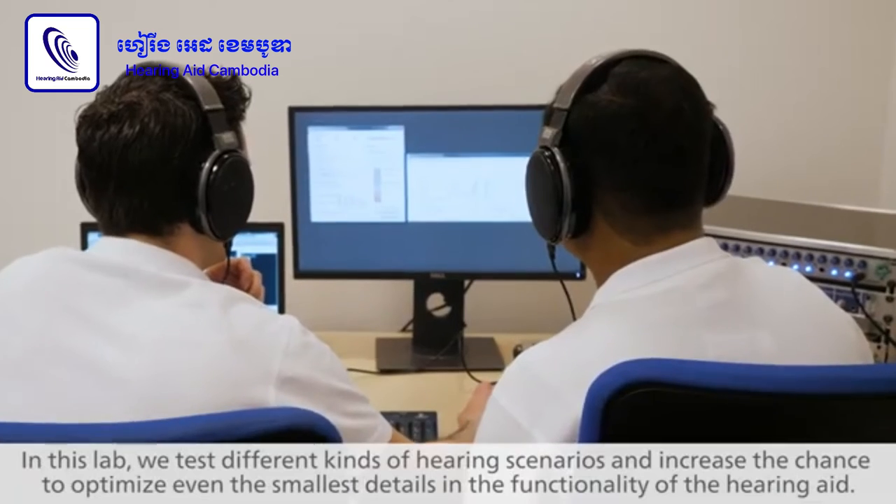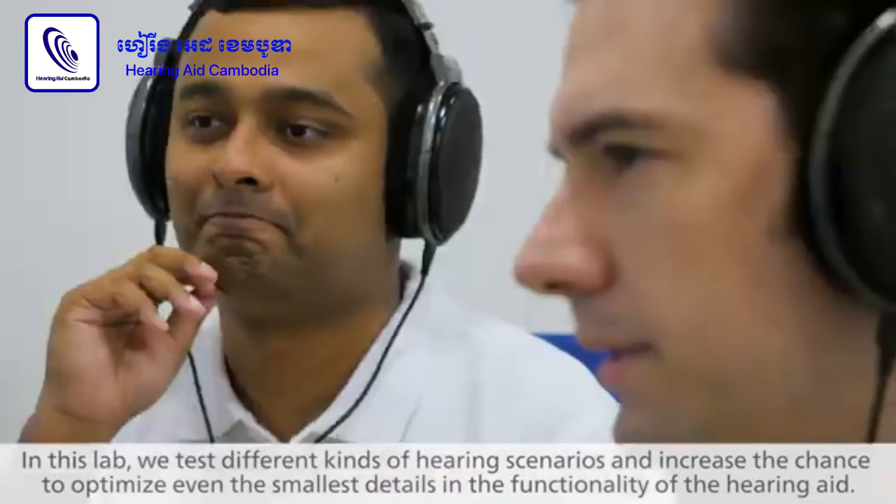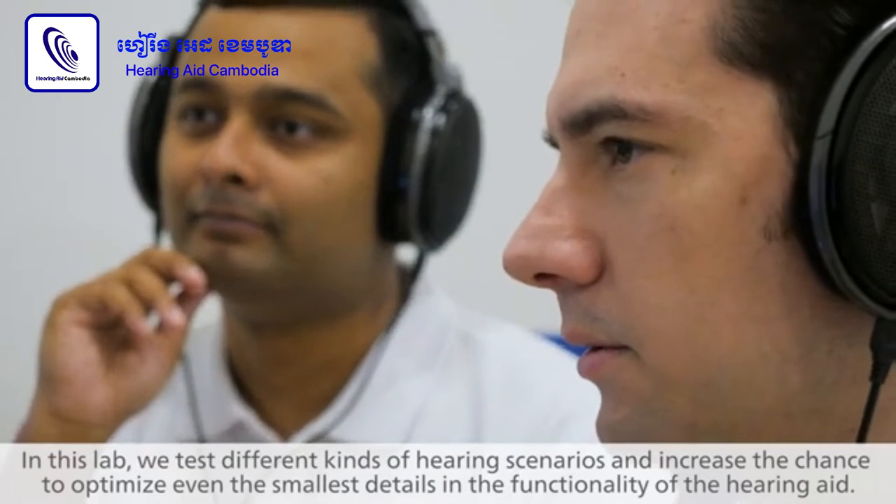In this lab, the possibility of playing different kinds of things enhances our ability to find out even the minor details in the functioning of the hearing aid.